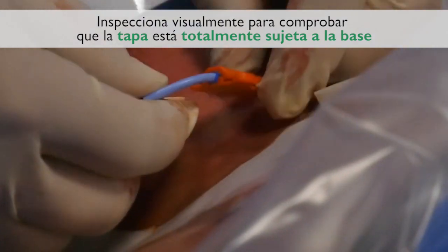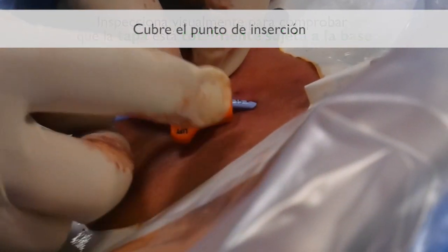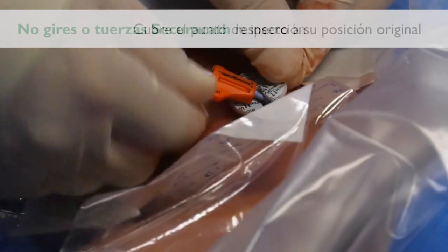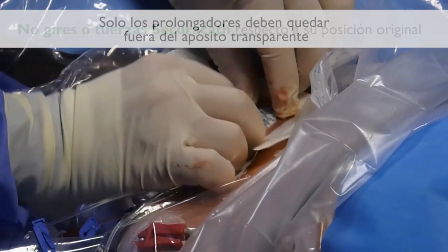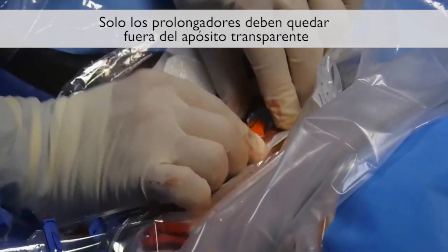Visually inspect to make sure the cover is fully engaged with the base. Dress the catheter site. Do not turn or twist the SecuraCath from its original position. Only the extension tube should be outside the transparent dressing.